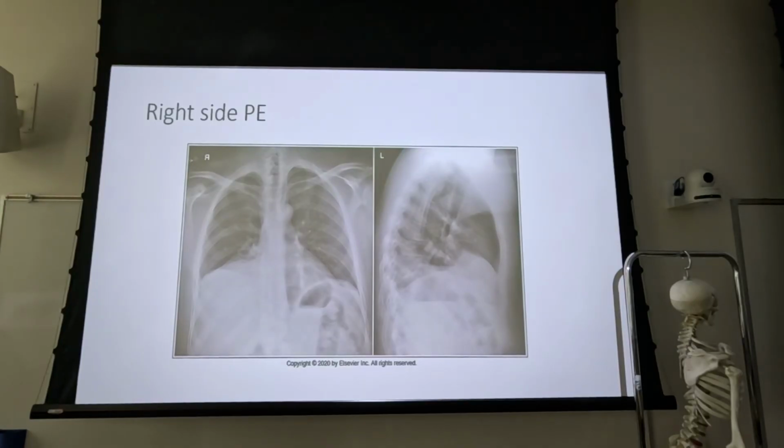What is causing collapse of the lung? Is this lung collapsed? At least partially, so it's some degree of atelectasis, right? If we were looking at an image with a massive pneumothorax, or any kind of pneumothorax, do we have atelectasis present? Yes, we've got at least a partial collapse of the lung. That's also atelectasis. Both of those just mean collapse of the lung. What's causing the collapse of the lung in this case is a pleural effusion, and the other one is a pneumothorax. So don't conflate those things.